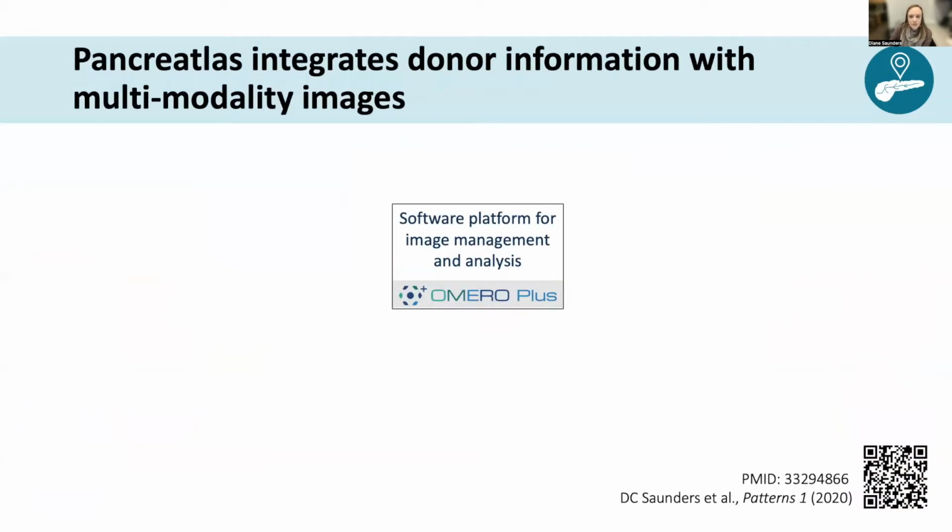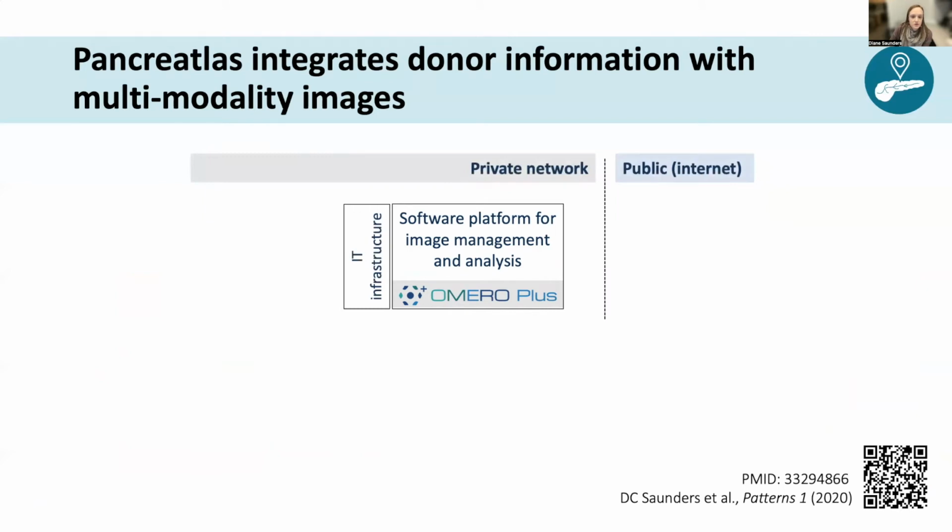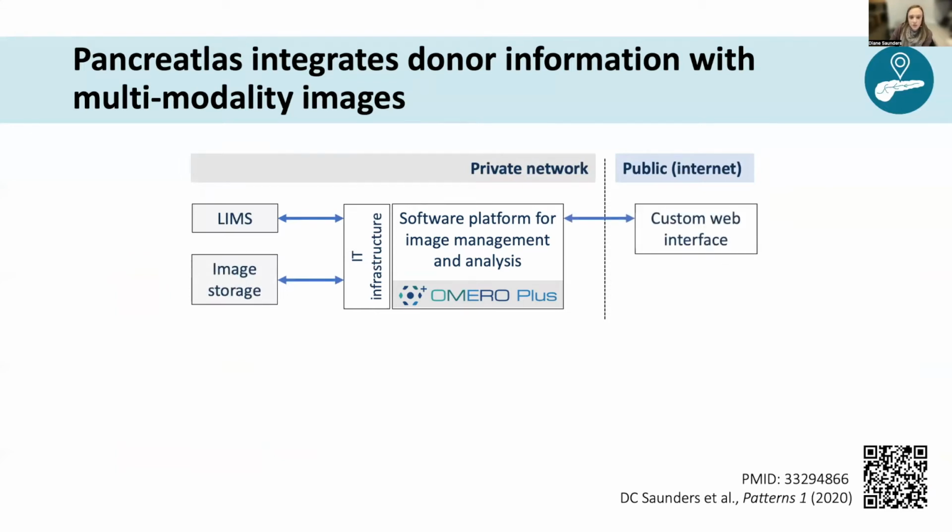We began with the backend infrastructure of Omero Plus, which is the licensed version of OME, the platform that takes advantage of Bio-Formats that many of you may be familiar with. This was connected to our institutional infrastructure, as well as our laboratory information management system and dedicated image storage. We then built a custom web interface, which seamlessly points users to Path Viewer, which is the image viewer associated with Omero Plus and similar to the OME iViewer.